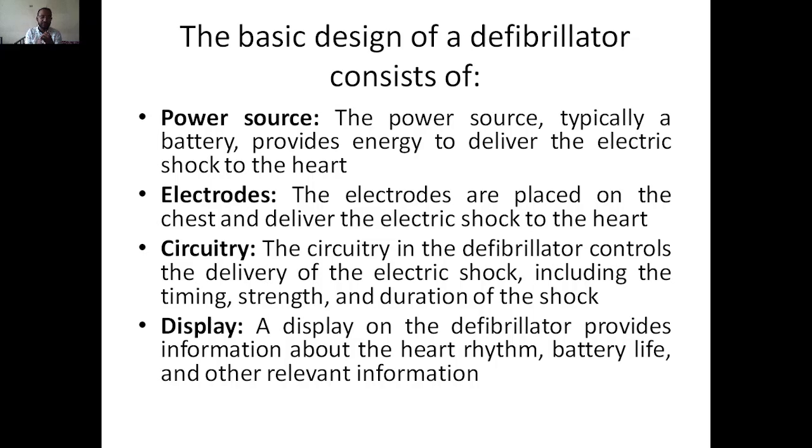So power source should be there, electrode should be there. We cannot directly give with the wires like electric shock like that. Electrode should be there, okay, that should be placed on the chest to deliver electric shock to the heart. And then electric circuitry will be there.